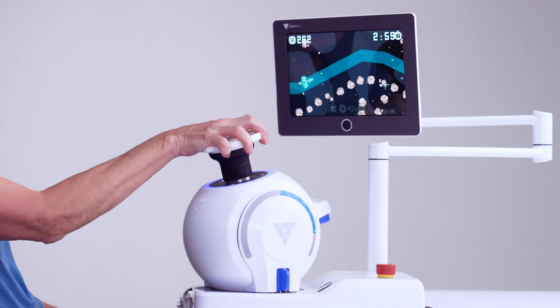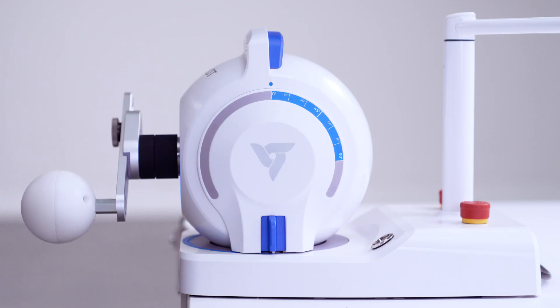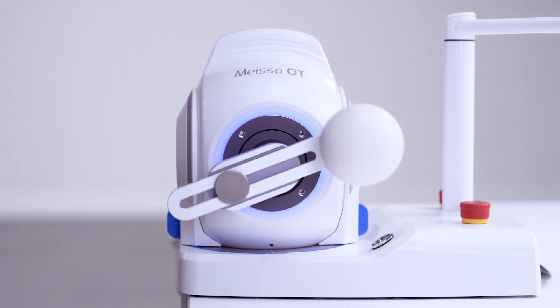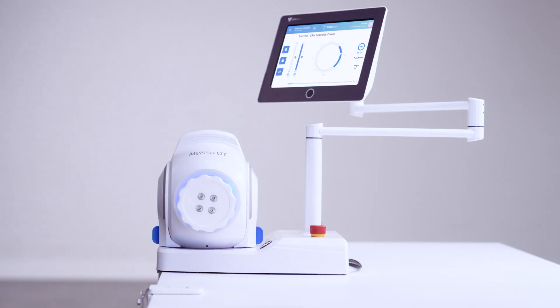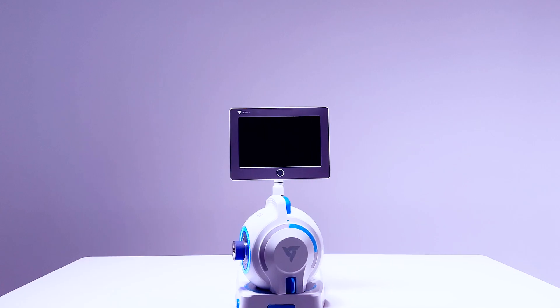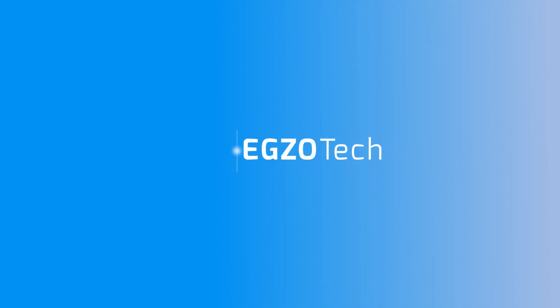Last but not least, let's have some fun with our configurable rehabilitation games. Get your Meissa OT robotic device and implement a successful hand therapy in your clinic. Visit egzotech.com for more information.